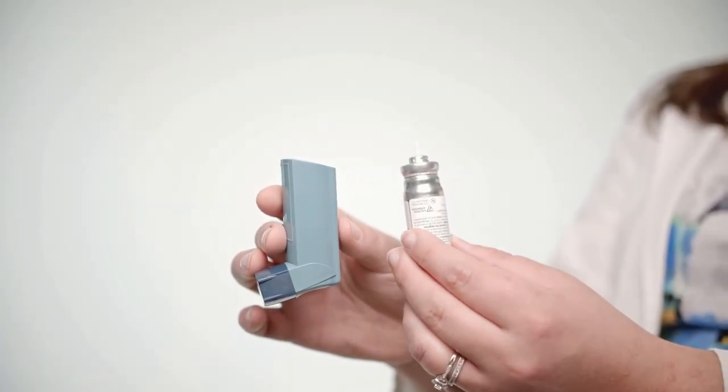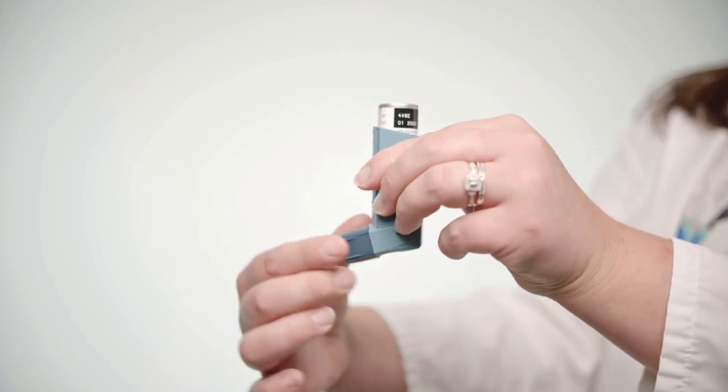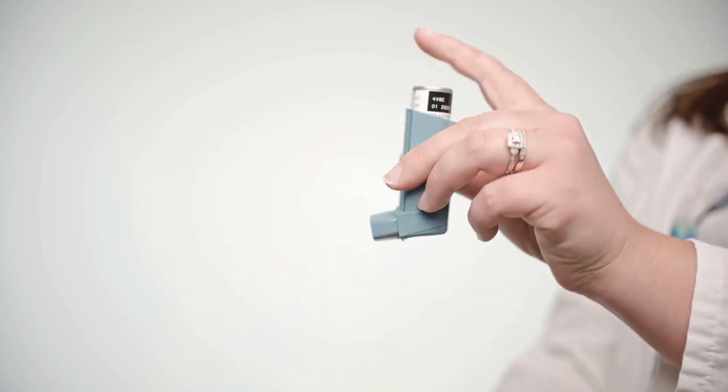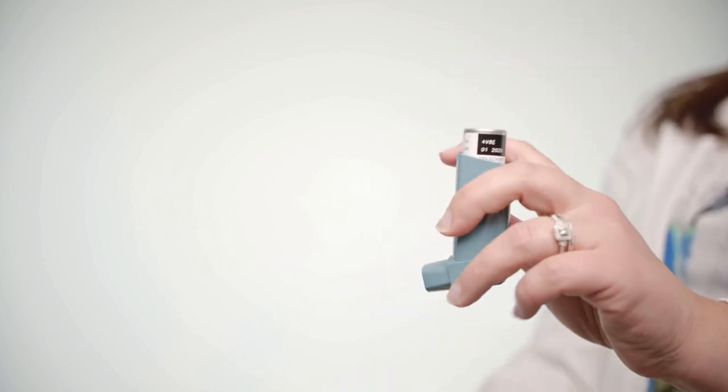Start by preparing the inhaler. Insert the medication canister into the top of the inhaler and remove the mouthpiece cover from the bottom. Shake the inhaler for at least a few seconds to ensure the contents of the canister are properly mixed.